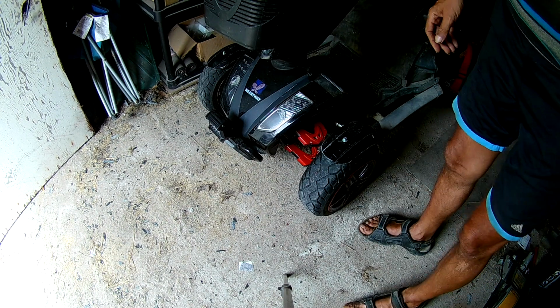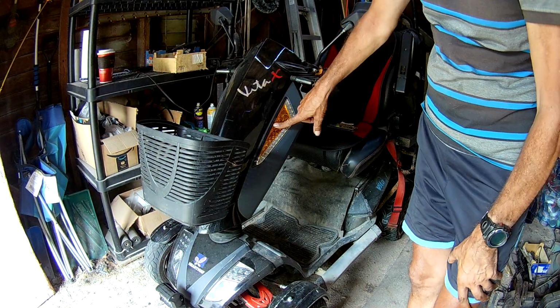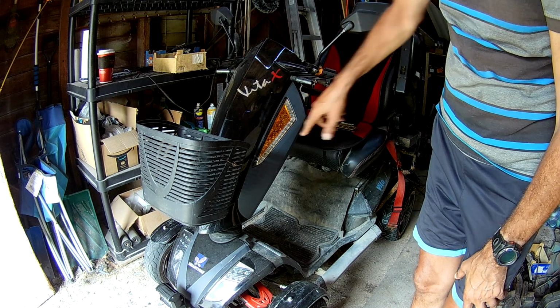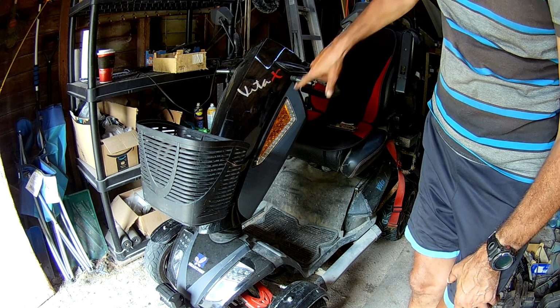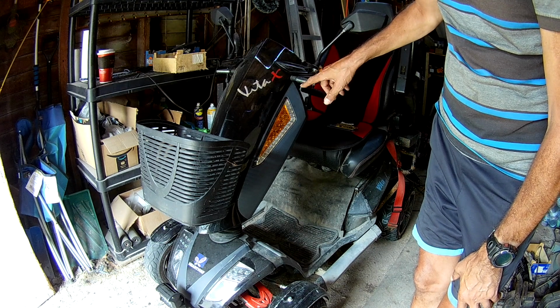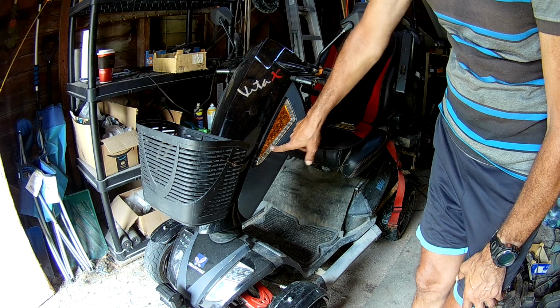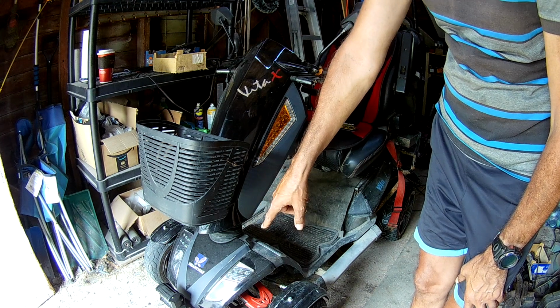So I'm thinking, because my four-ways are working, the only thing I've tapped into up here are these four-ways. Because I put these on and I had to tap into those to power these. So that has nothing to do with the white lights. They should not be a problem. It doesn't explain the orange lights down there.